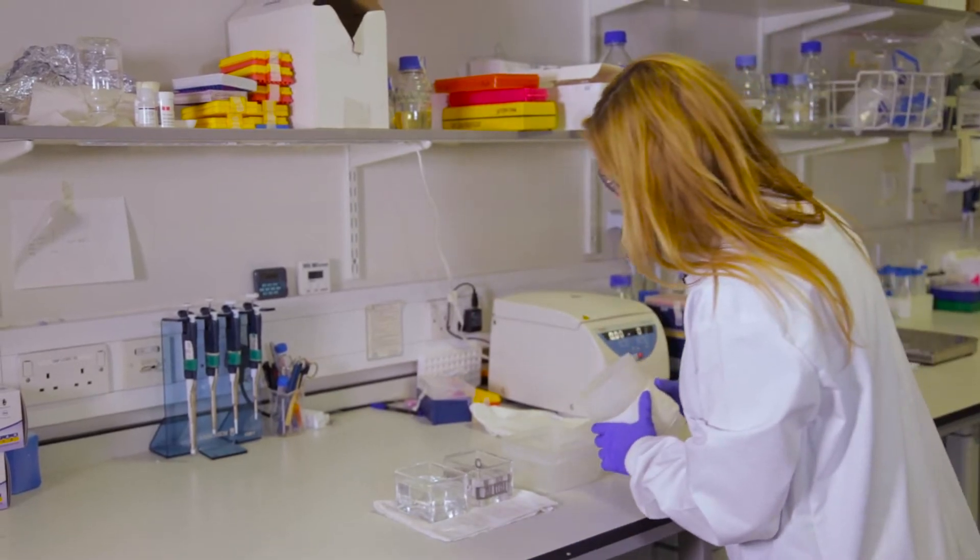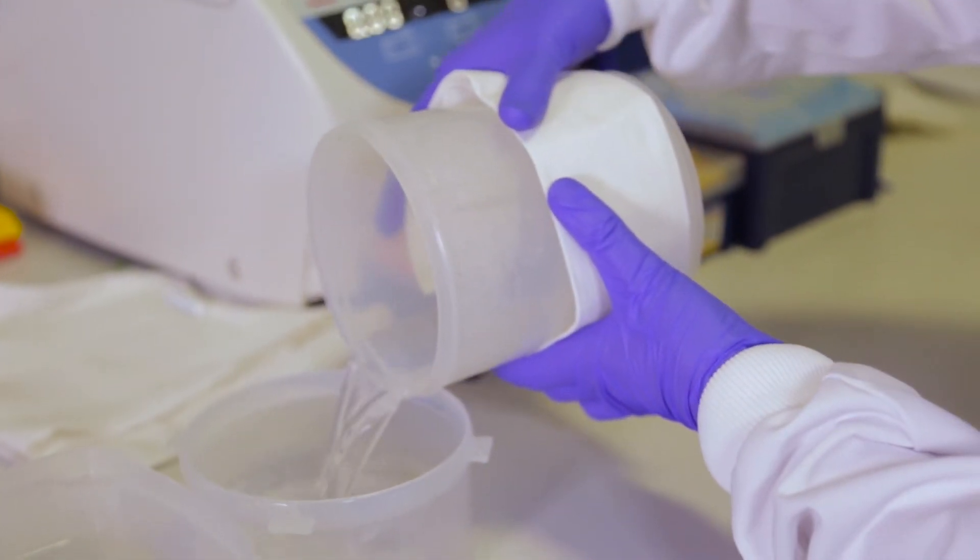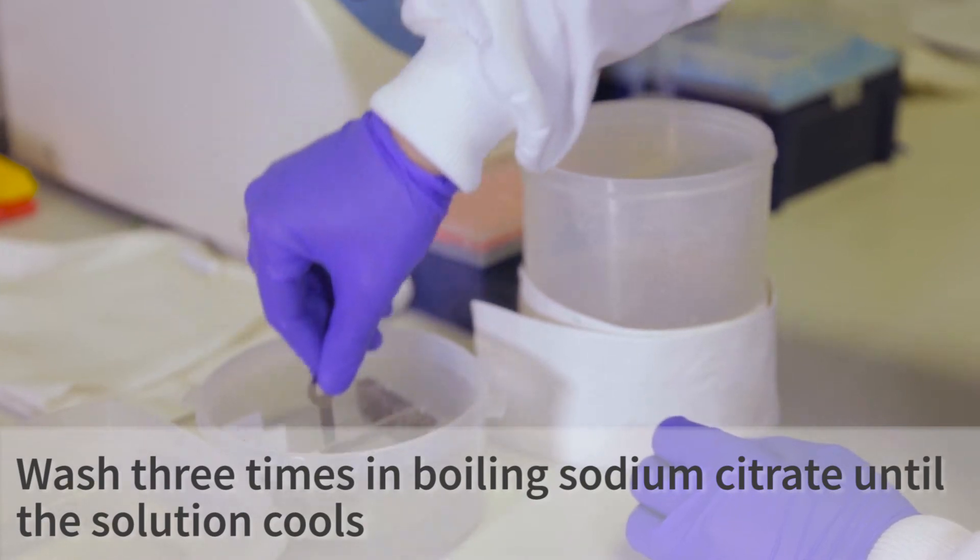The next step is antigen retrieval. For this, we use boiling sodium citrate. After your final PBS wash, you can move the slides into a container of boiling sodium citrate. We do this three times.